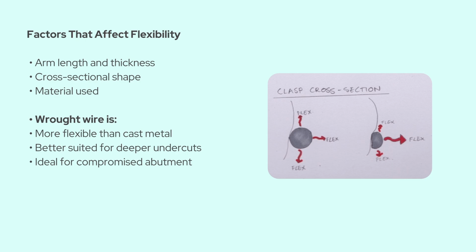Whenever we can, try to choose clasps that naturally follow the tooth's existing contours. But if small enamel modifications help improve retention or reduce stress, we shouldn't avoid them. Sometimes just a minor adjustment can make a huge difference biomechanically.